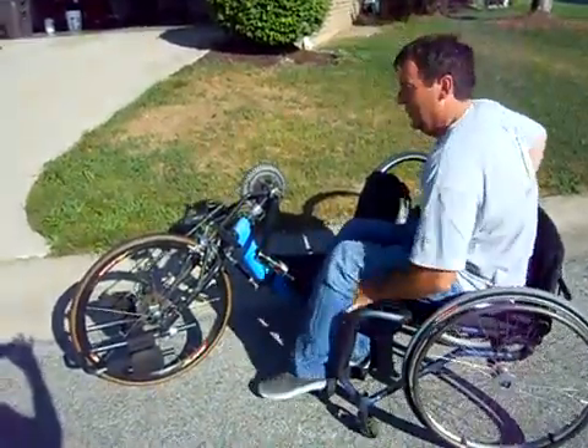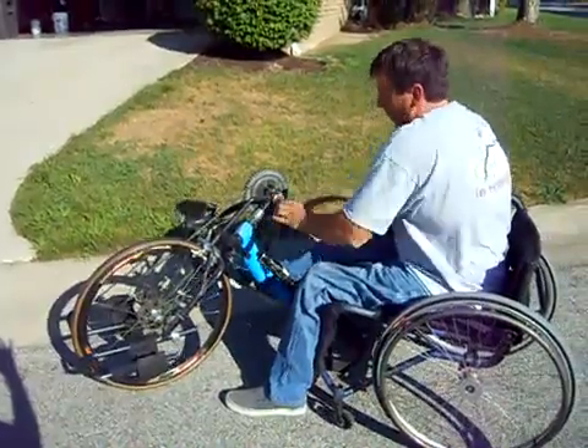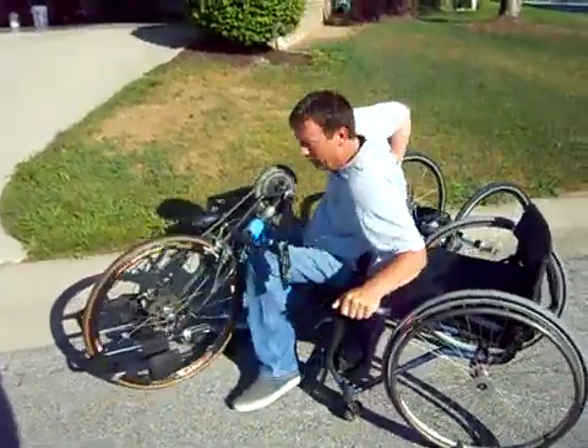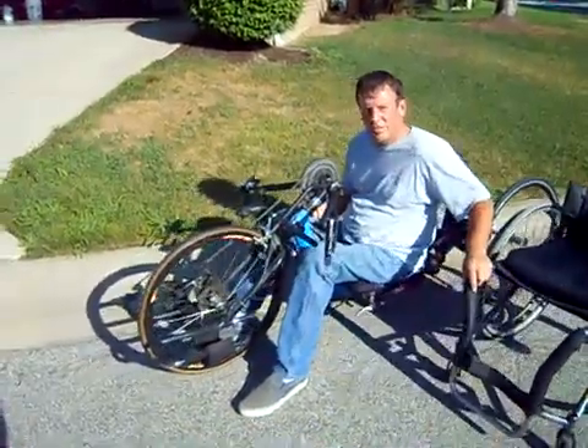All right, climbing in — take one leg, throw it over, transfer over to the seat. It's pretty straight, vertical. It's just like sitting in the chair.